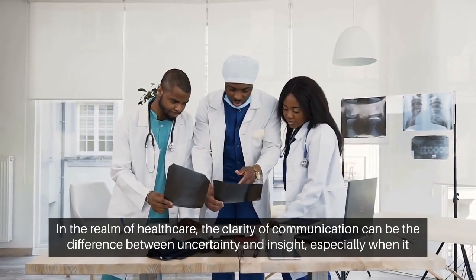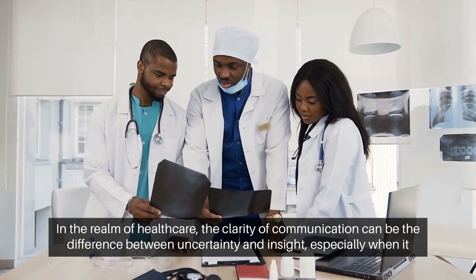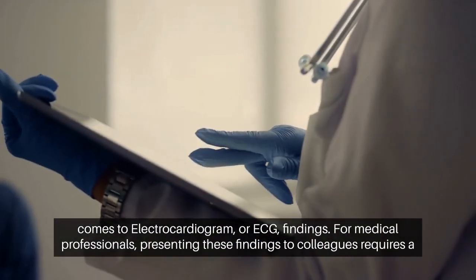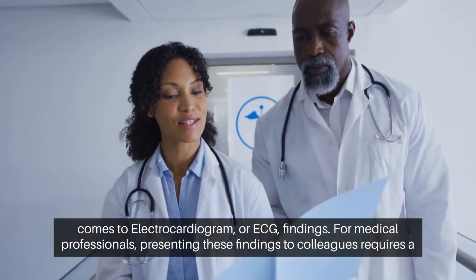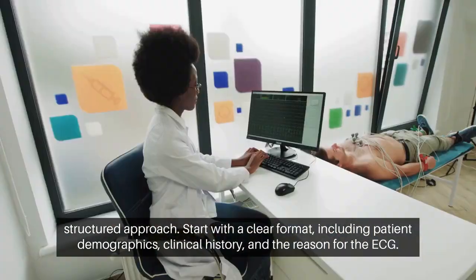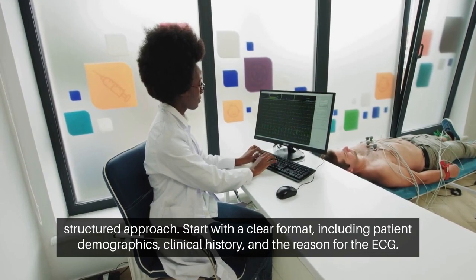In the realm of healthcare, the clarity of communication can be the difference between uncertainty and insight, especially when it comes to electrocardiogram or ECG findings. For medical professionals, presenting these findings to colleagues requires a structured approach. Start with a clear format, including patient demographics, clinical history, and the reason for the ECG.